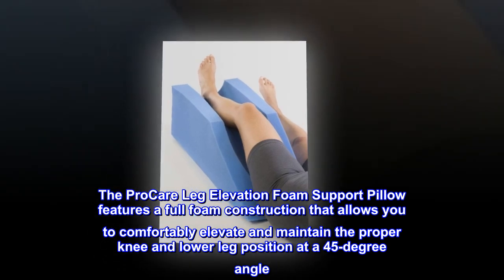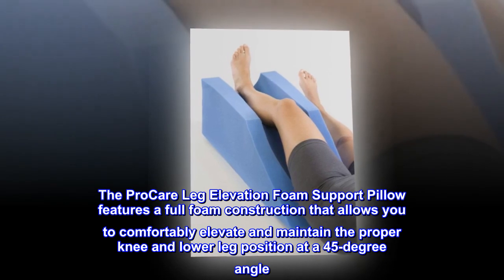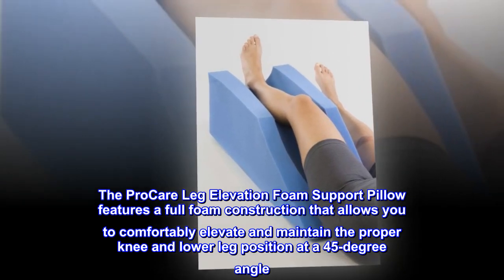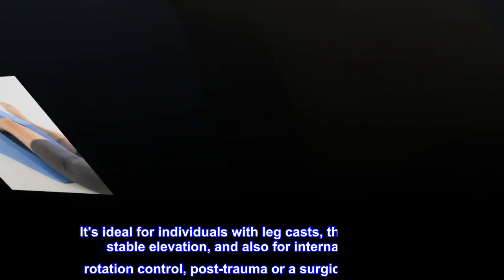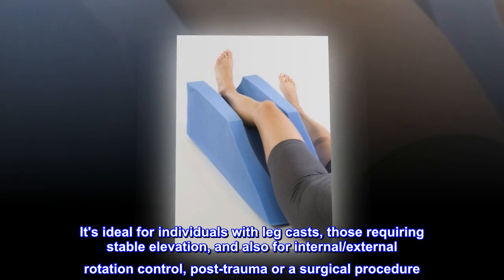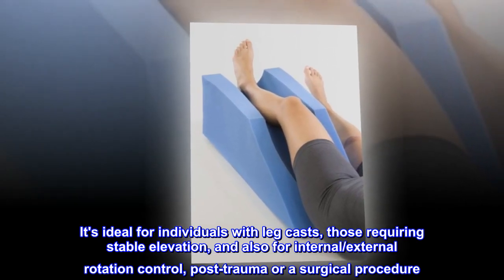The ProCare Leg Elevation Foam Support Pillow features a full foam construction that allows you to comfortably elevate and maintain the proper knee and lower leg position at a 45-degree angle. It's ideal for individuals with leg casts, those requiring stable elevation, and also for internal and external rotation control, post-trauma or a surgical procedure.